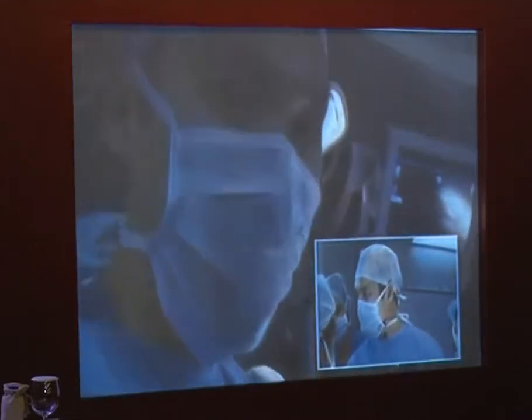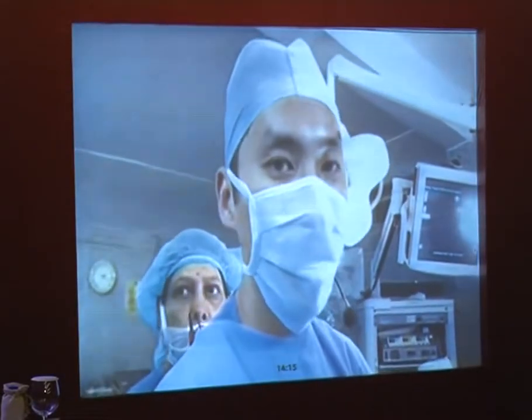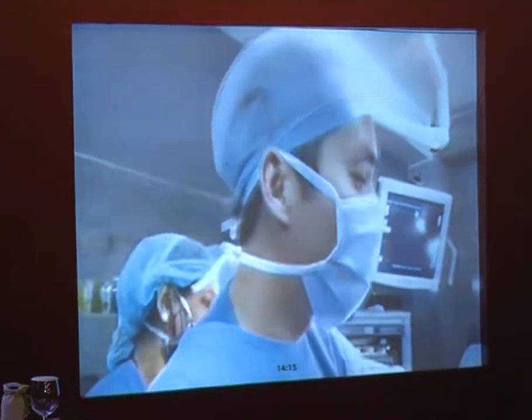We have a manipulator in the uterus, and that way we have some ability to keep the uterus controlled during the time that we are doing the enucleation. Let's go ahead and clear the way here so we can side dock. We'll be side docking, so you may want to show that and bring the camera over to the side.